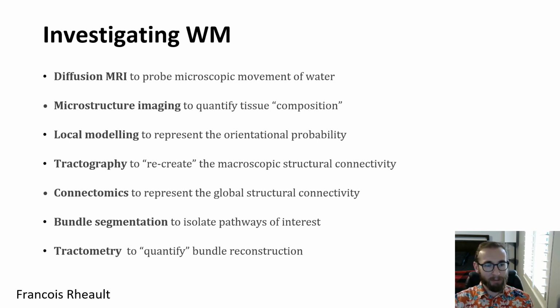So what I want to do today is just to give an idea of the line of thought that we have when we process diffusion MRI data. So you have an idea of what comes before what and what has an impact on the following step, just to give some context on the DIPY workshop as a whole.